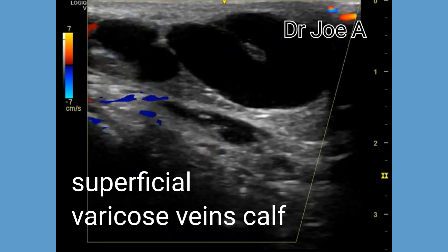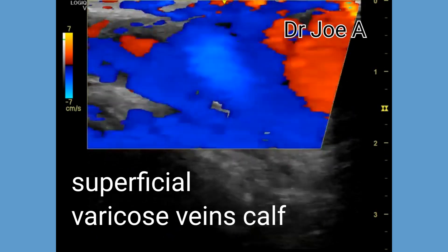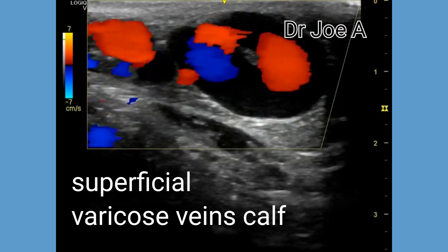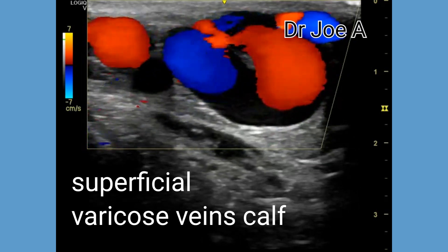Coming to the calf, there are multiple massively dilated varicose veins seen in this region in close relation to the great saphenous vein. Turbulent flow is seen even in these superficial varicose veins.